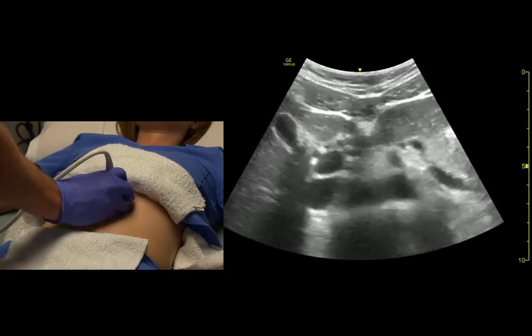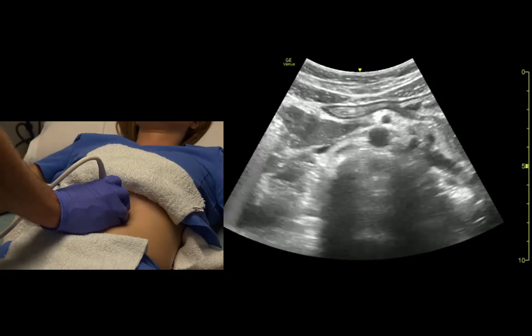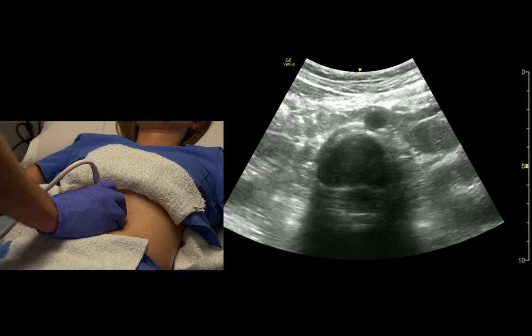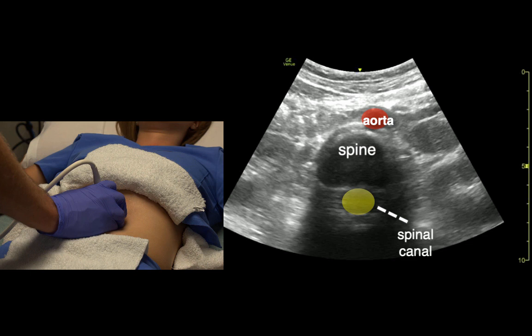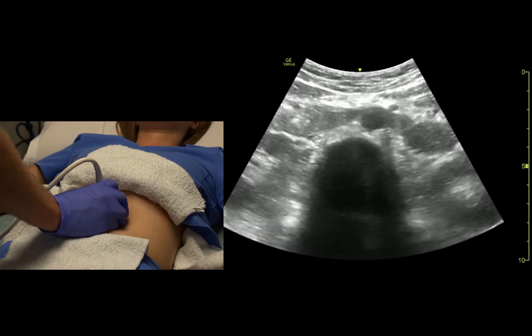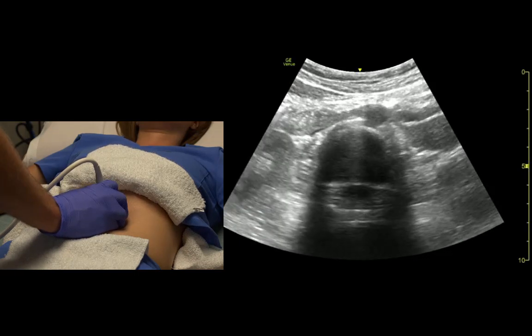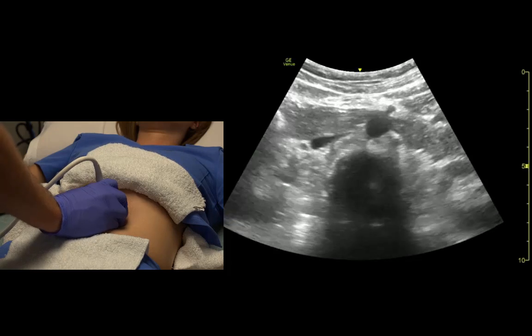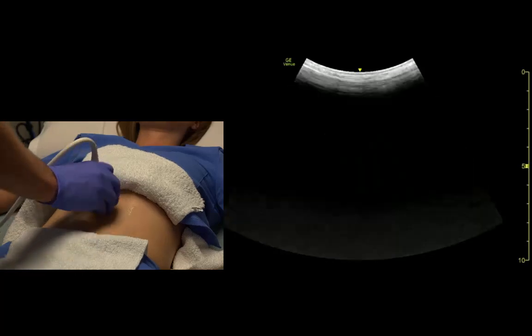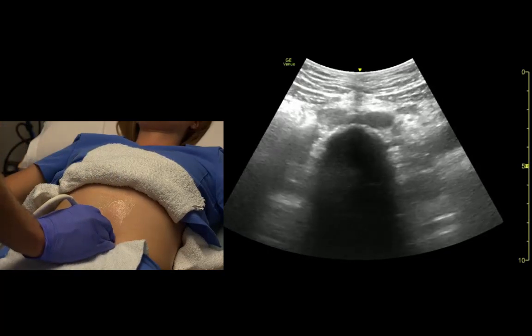From here we might as well follow the aorta all the way down. Sometimes as we're following the aorta, we look for the spine — if we catch the intervertebral disc, we can see the spinal canal sitting behind the disc. We want to follow the aorta until it splits into the right and left iliacs, which is right there.